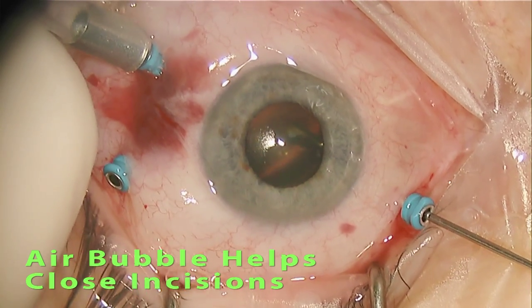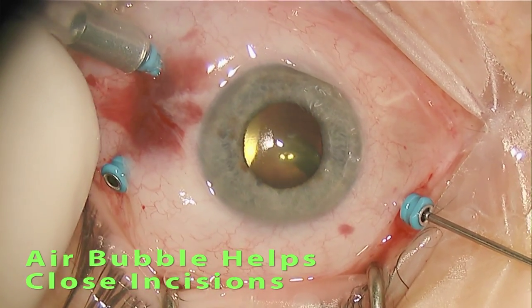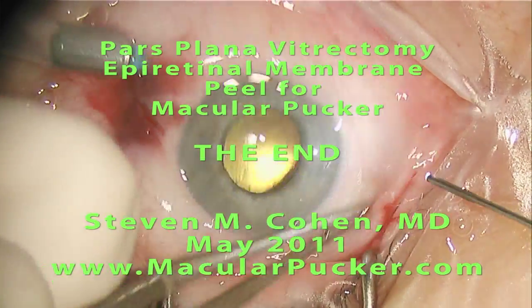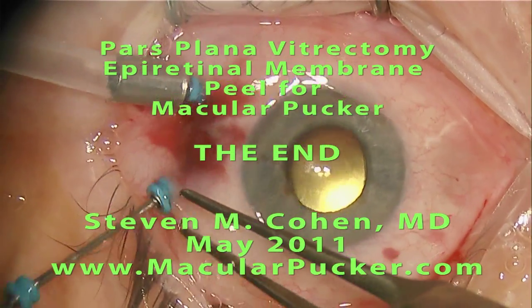At the conclusion of the case, a small air bubble is placed in the eye. I hope you found this video instructive. There's much more information on macular puckers at the website macularpucker.com.